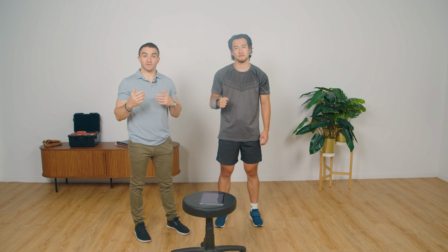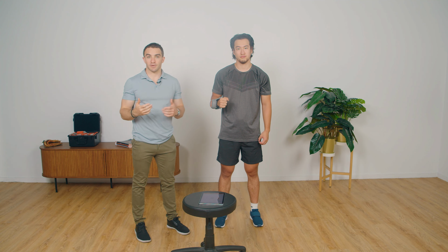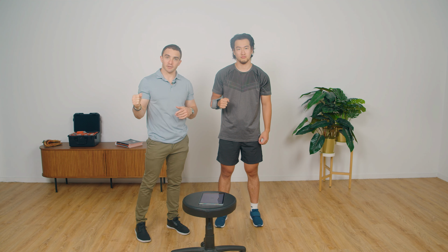Similar to giving a patient feedback on their range of motion and training proprioception, the dynamometer is a really good device to help give that patient feedback. And then we can progress this into some of their isometric training rather than just having them push into a fixed object. Using the dynamometer gives them an understanding of how much force they're applying.